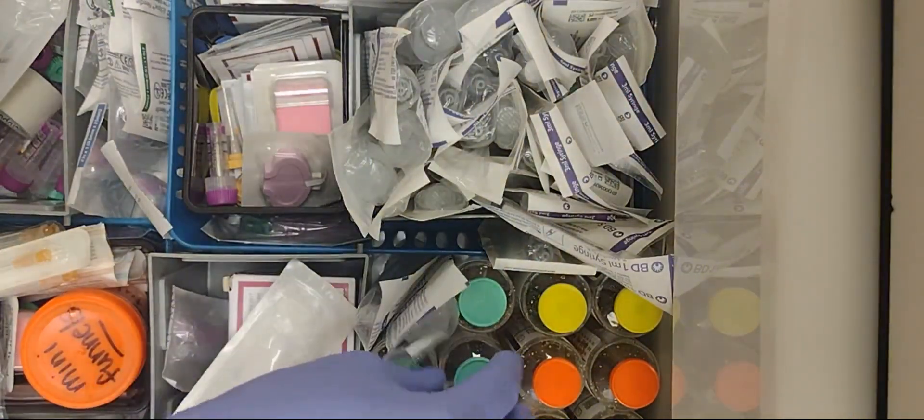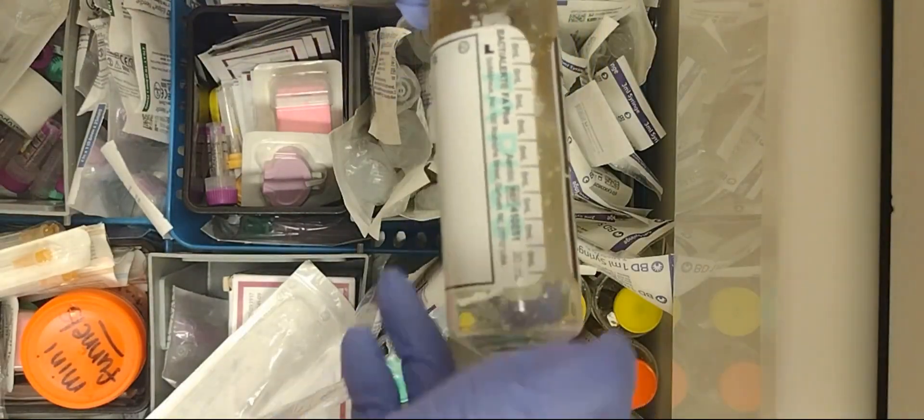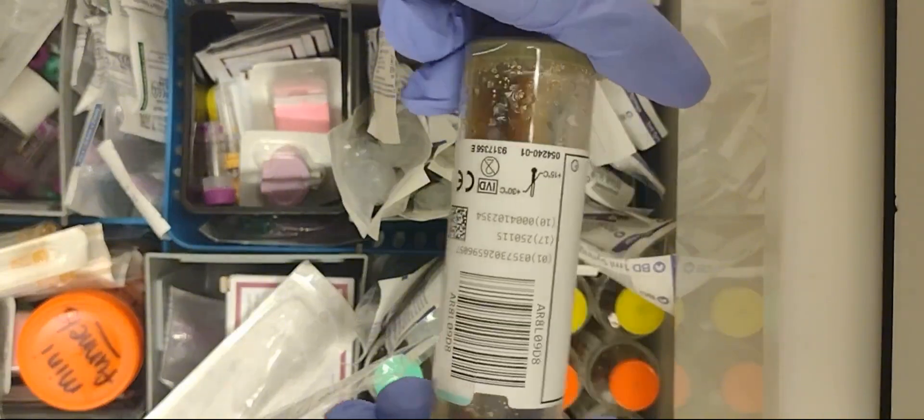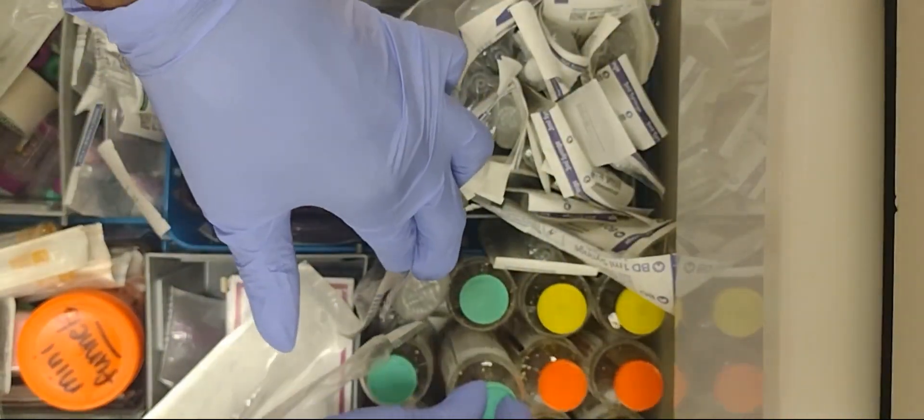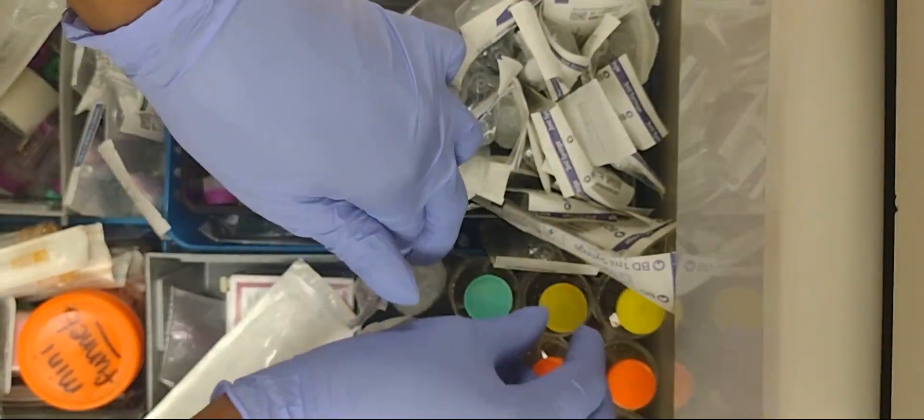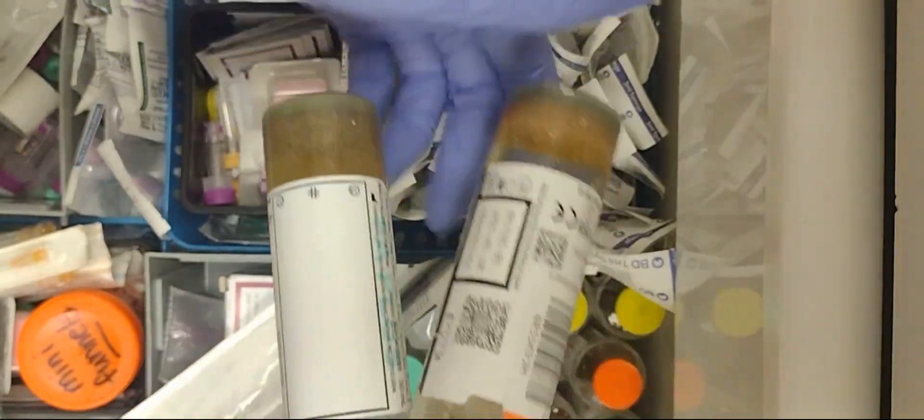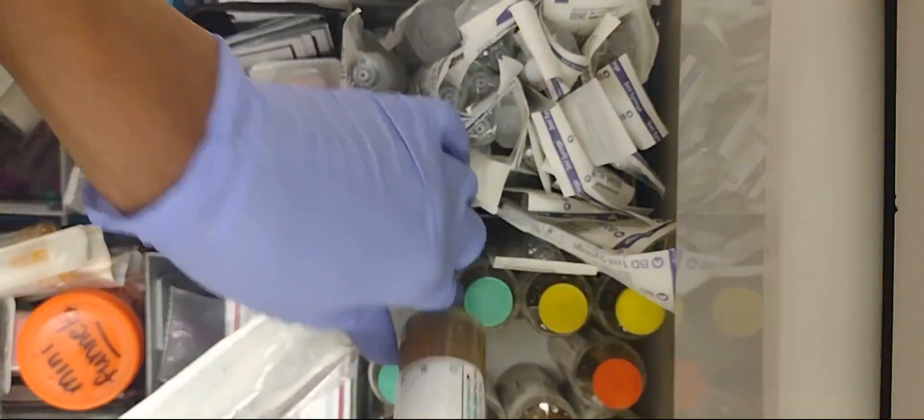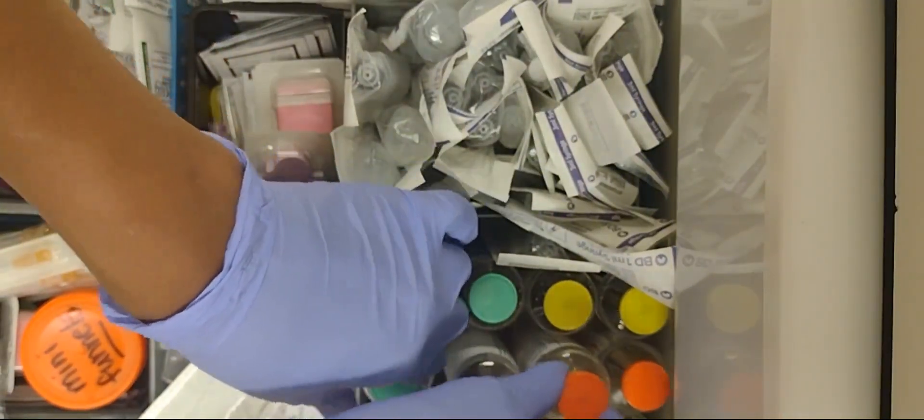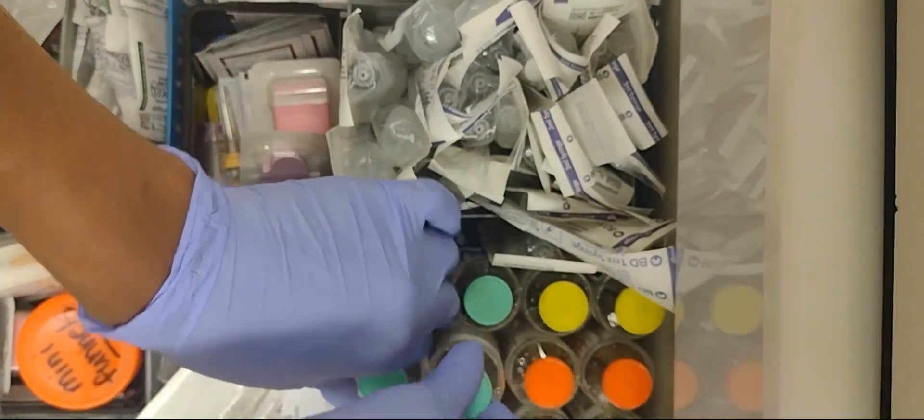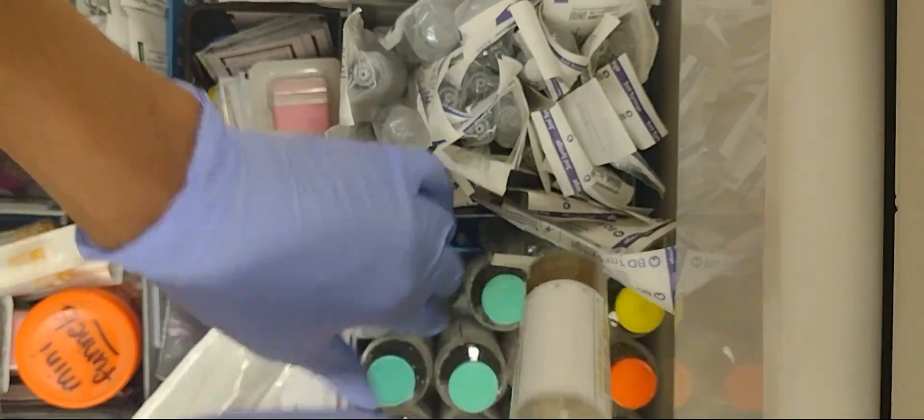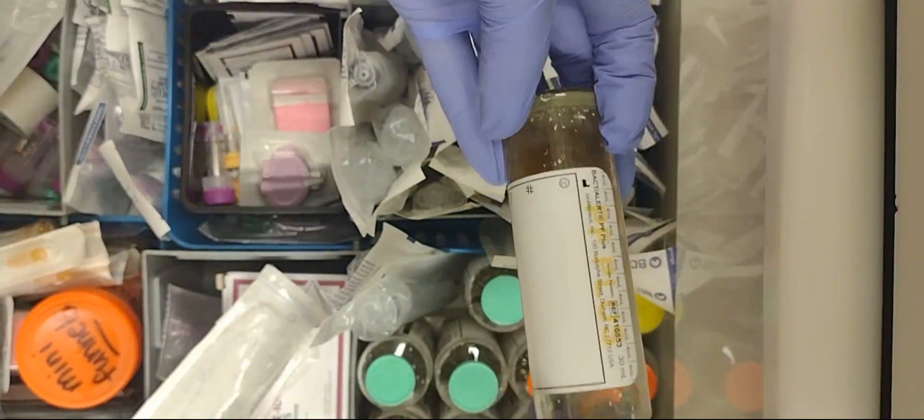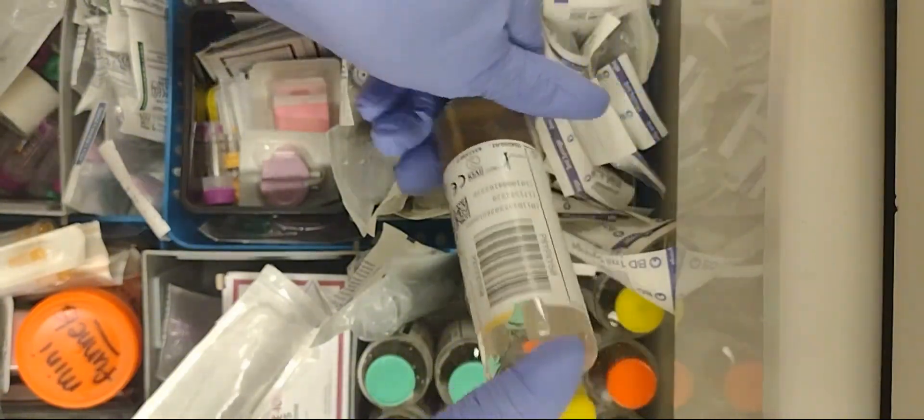These are blood culture bottles. So if they think a patient is septic, they'll order blood culture bottles. You'll have to collect the orange and a green set. This is supposed to put five ml's in each bottle. We'll talk about that on a later video if y'all are interested.